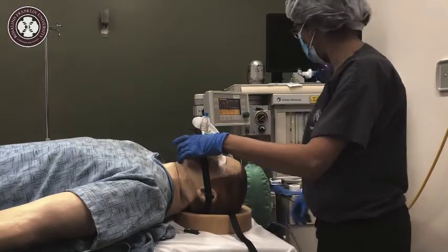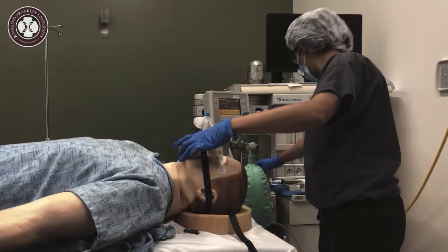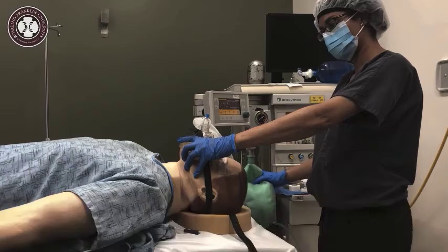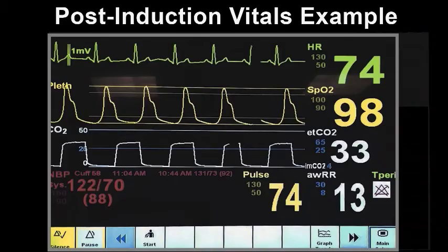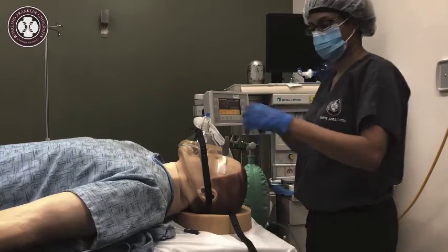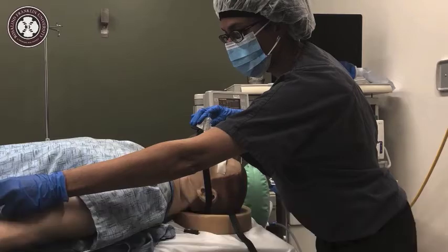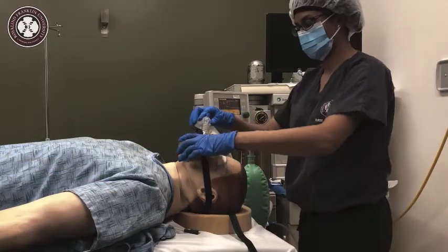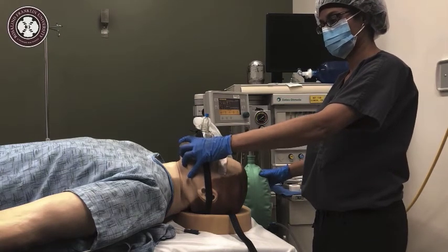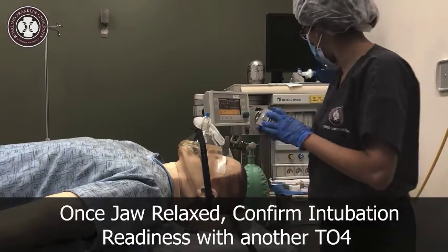Now that the patient is apneic, mask ventilation is required. Before beginning, slightly close the APL but keep the setting less than 20 to avoid gastric insufflation. Confirm proper ventilation via bilateral chest rise and a consistent end-tidal CO2 tracing. Once the ability to mask ventilate is confirmed, a baseline train of four must be checked. Then administer the appropriate neuromuscular blocker and continue mask ventilating. Required mask ventilation time varies based upon the drug onset. Jaw relaxation and a decreased amount of force needed to squeeze a reservoir bag will begin to be noticed. After sufficient time and jaw relaxation occurs, a second train of four must be done to confirm intubation readiness.